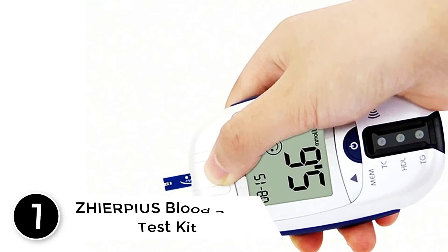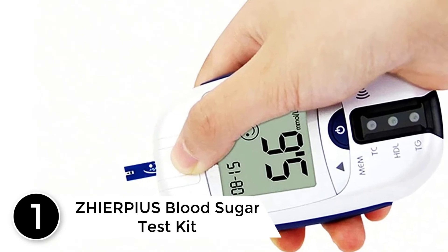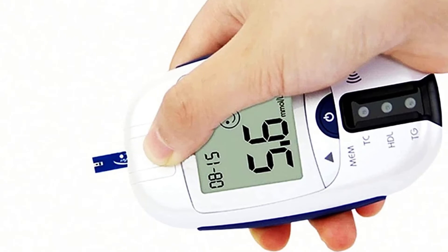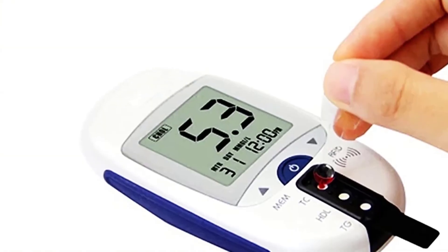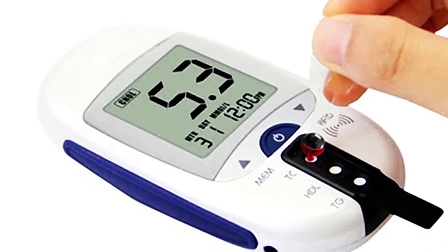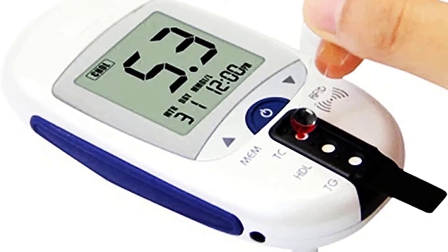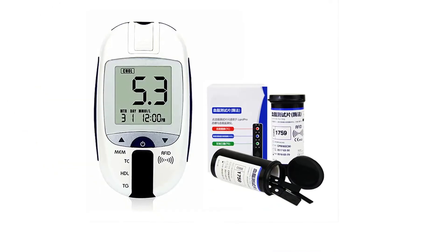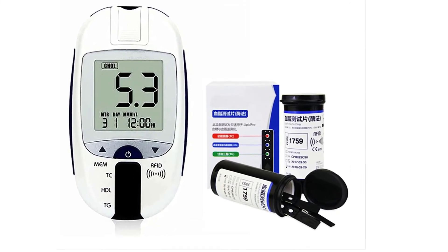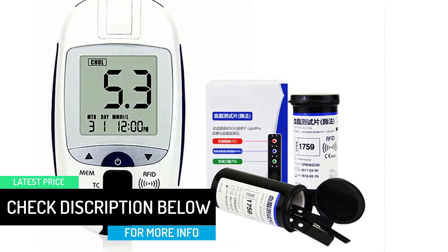Finally at number 1: ZHIERPIUS Blood Sugar Test Kit. The large LED display is suitable for people of any age, and the latest detection chip is faster and more accurate. Painless micro-blood sampling — almost no pain, no need to squeeze blood. Not afraid of pain when measuring sugar. LCD high-definition large screen and large font display means the elderly with poor eyesight can also easily read. The print report supports connecting to a printer — 3 seconds to print and store the results, which is convenient and quick.